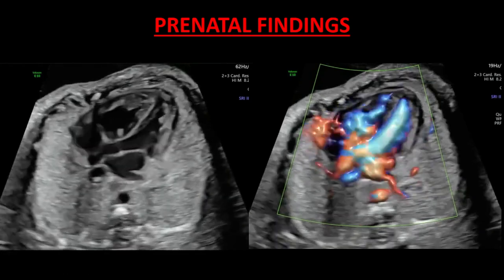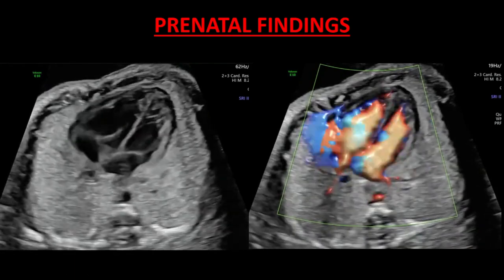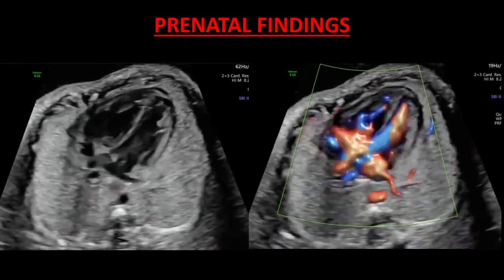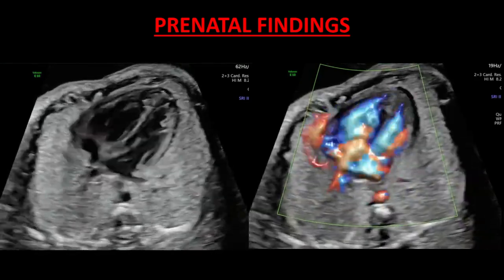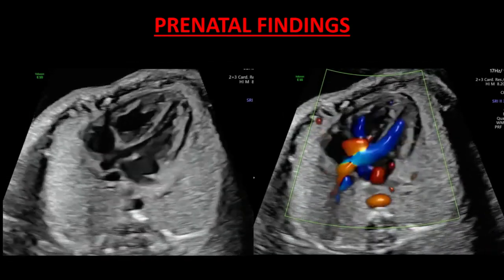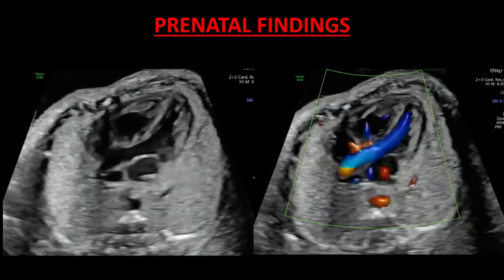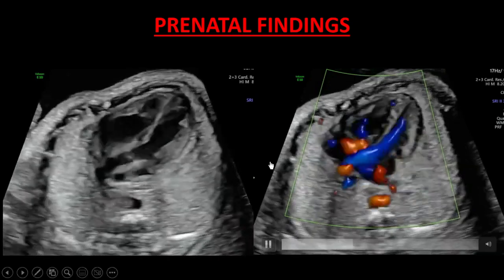But what is really catching the eye is that the baby's heart rate is a little bit lazy. I think that you can see that. When the baby moves around, there is supposed to be some kind of acceleration, deceleration, but the baby is kind of sleeping all the time, and the heart rate is nice and regular, but not really high enough in terms of rate. So we were observing that for quite some time.